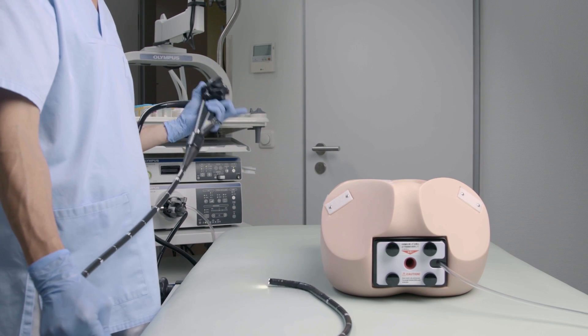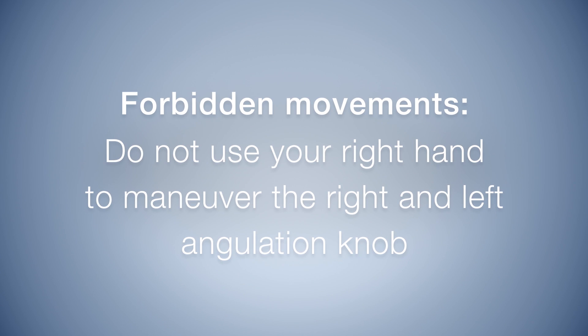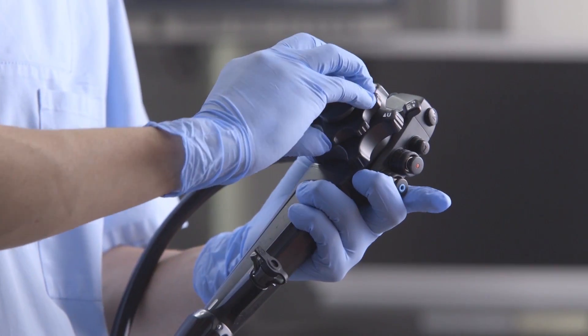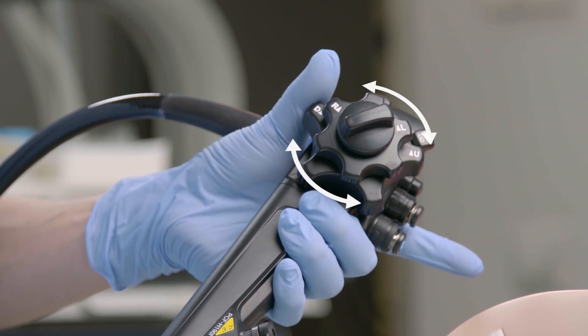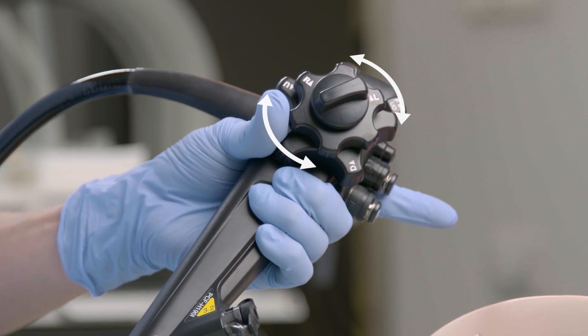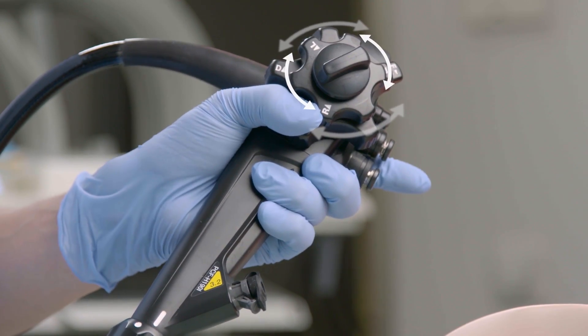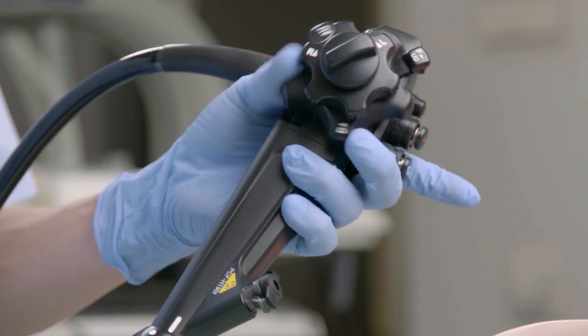Twisting your wrist at the control body is crucial for a rotational effect at the tip of the endoscope. Another forbidden movement: don't use your right hand to do the right and left angling. To manipulate the endoscope, you want to use up and down angulation with the joint of your thumb — up, down — and with the tip of your thumb, left and right. Now you can combine these movements.